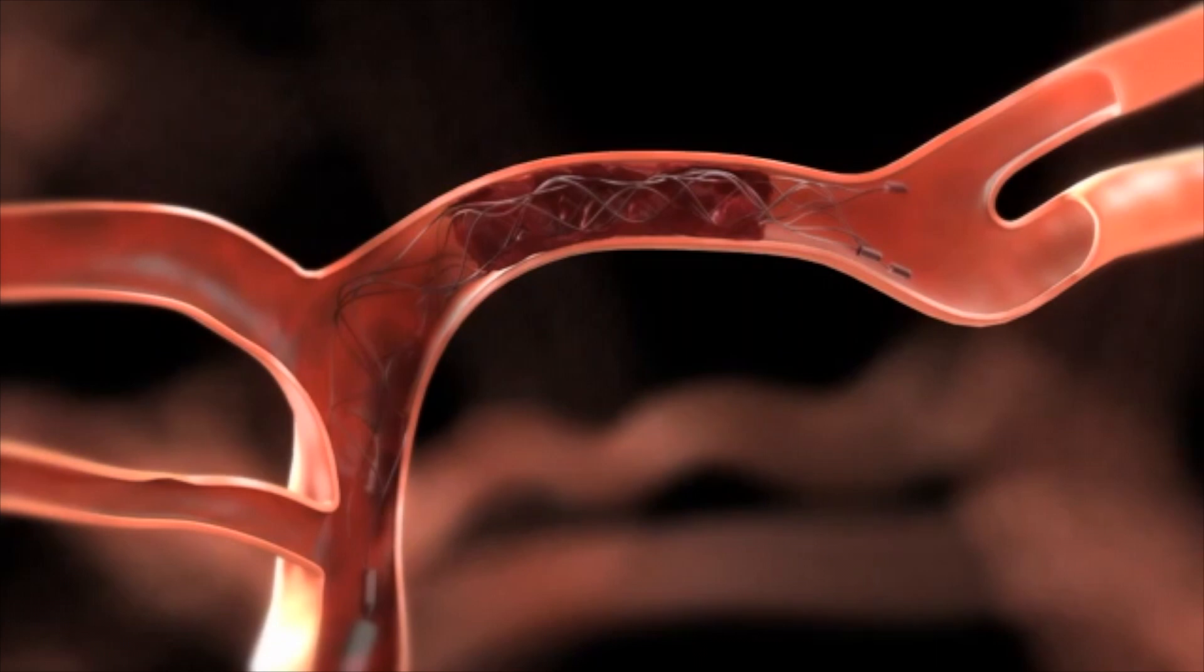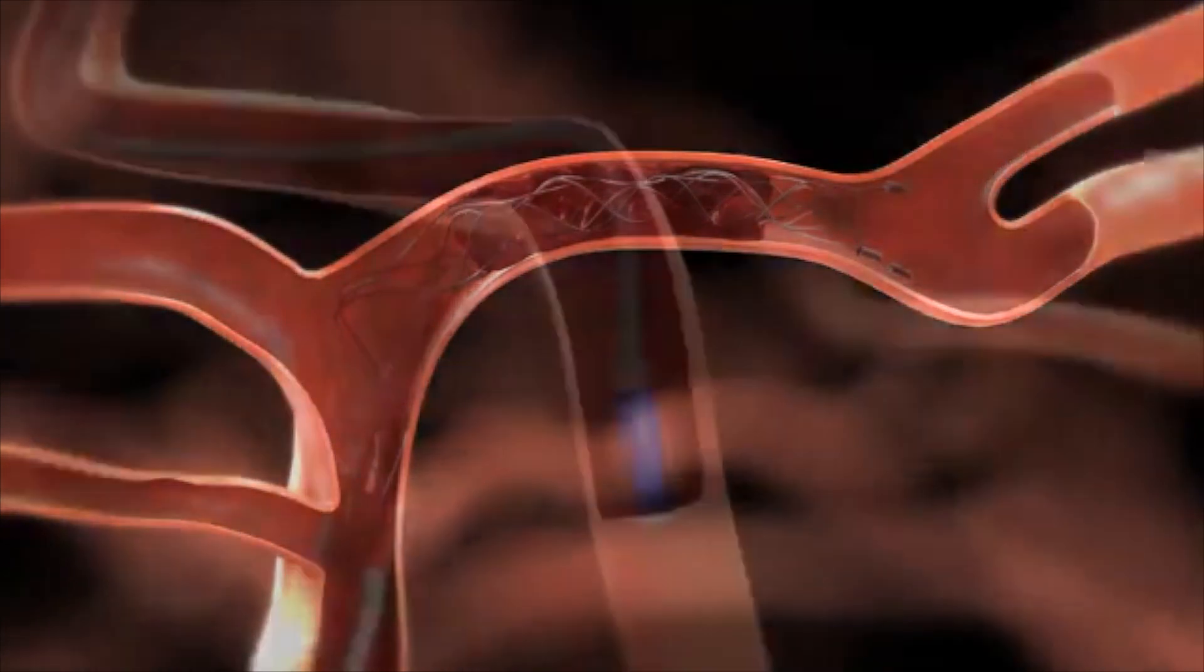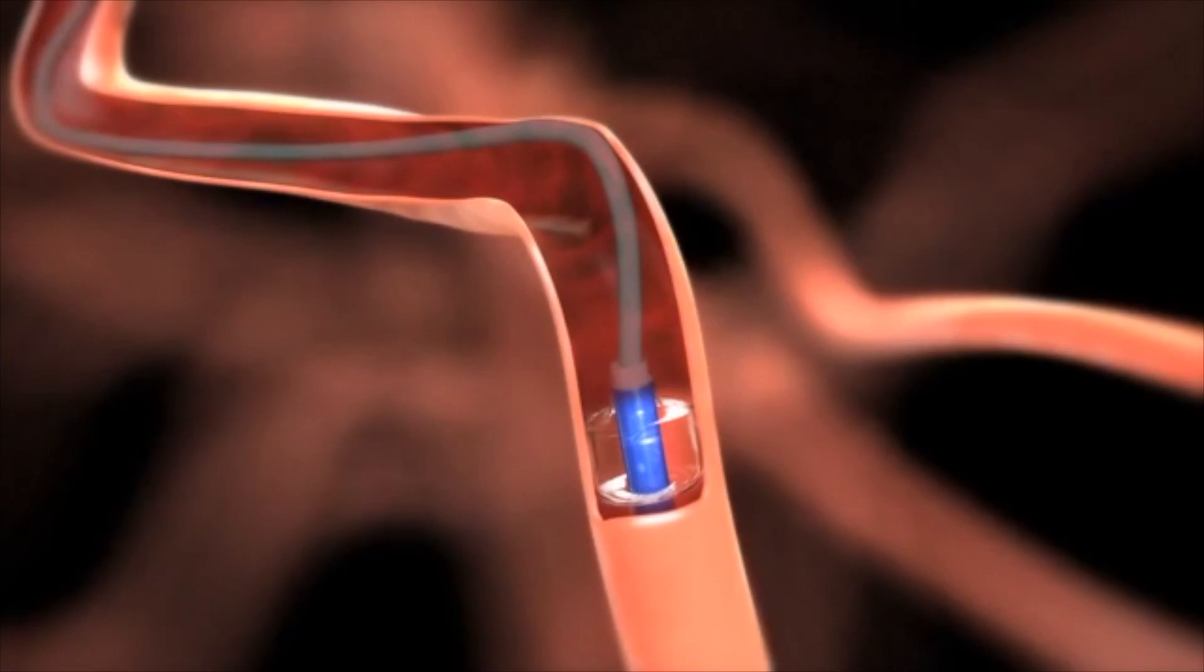Inflate the balloon of the guide catheter to occlude the vessel.